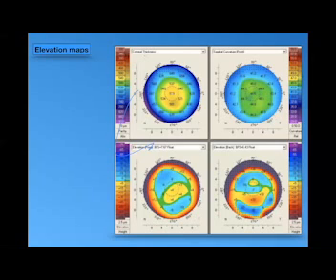To be safer, you may go for the femtoflap. You're asking about no risk for ectasia, Dr. Hossam? Are you asking about the ectasia or the flap-related complications? Yes, ectasia. Is there any risk of post-LASIK ectasia?